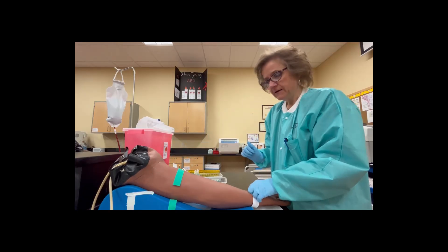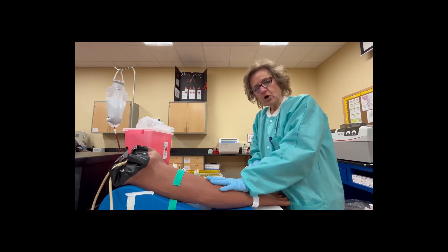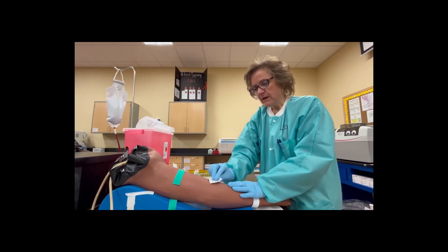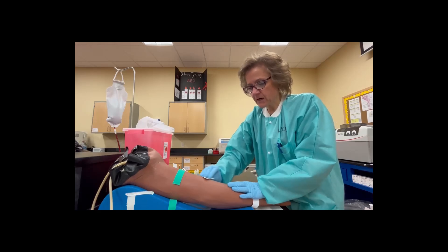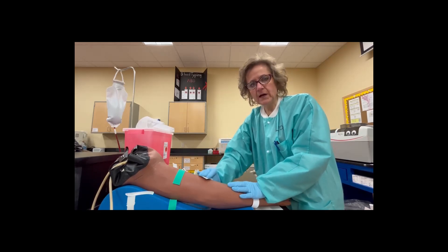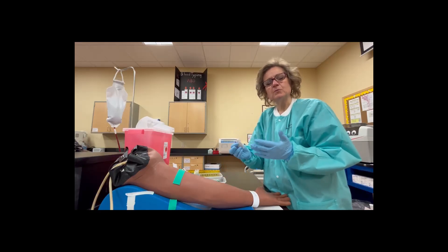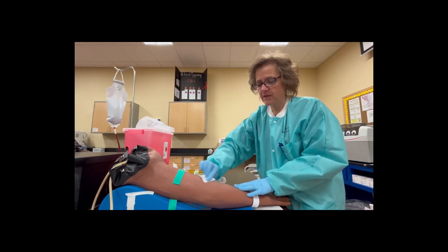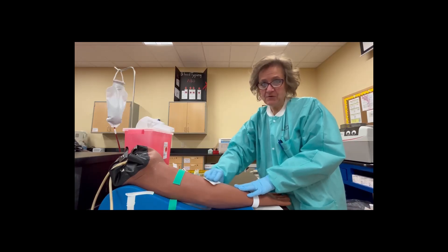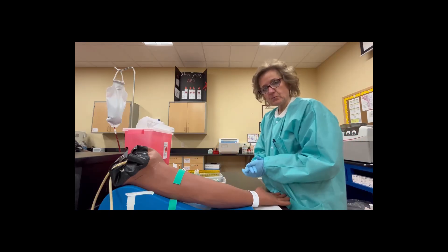Now I know how the vein is formed, the direction it's going, and where I'm going to go in, so I'm going to untie the tourniquet and get my alcohol wipe. We don't actually use alcohol on the fake arms because it deteriorates the rubber, so I'm just demonstrating — doing nice circular scrubbing up and down. When we're scrubbing, we're scrubbing off loose epithelial cells and getting all the bacteria on the arm. We are not sterilizing the arm, we are just cleaning it.